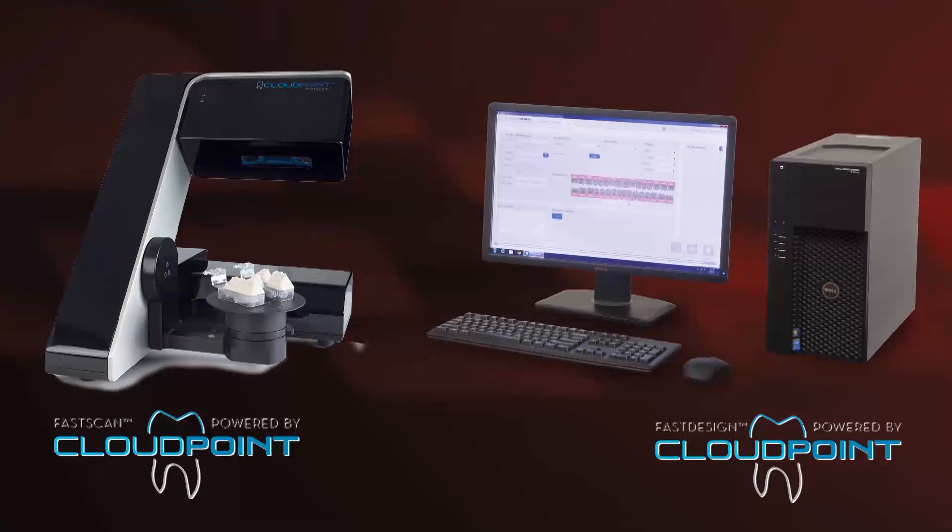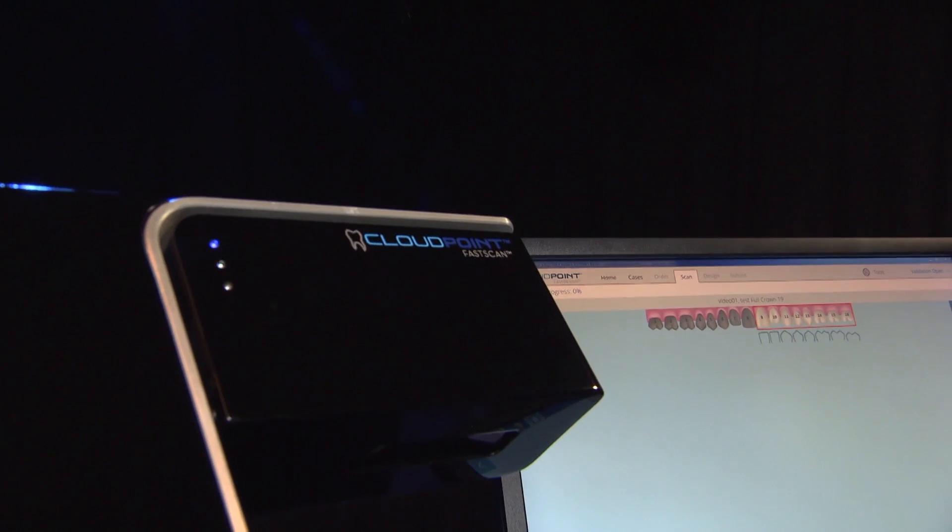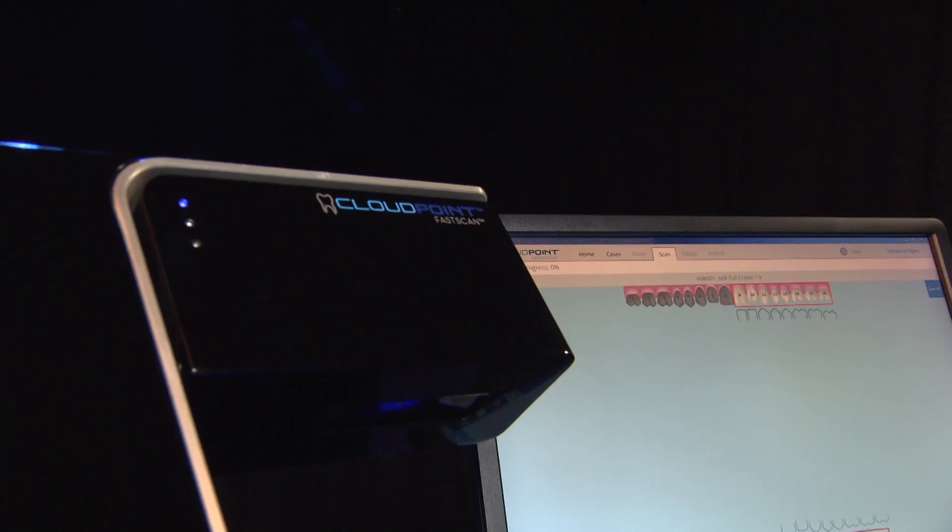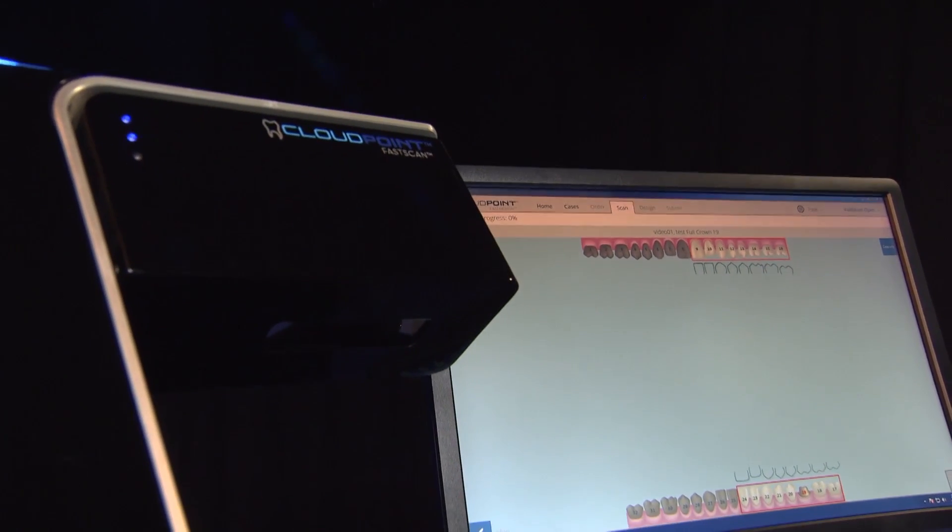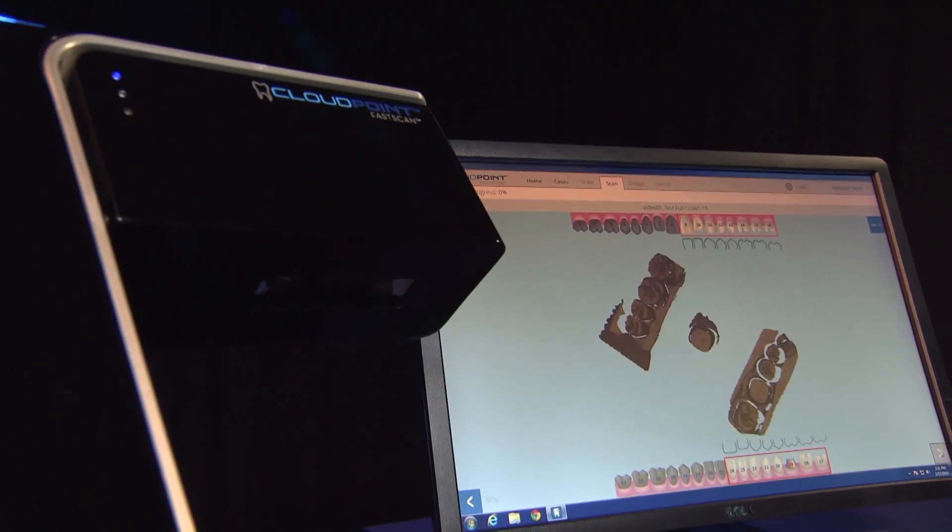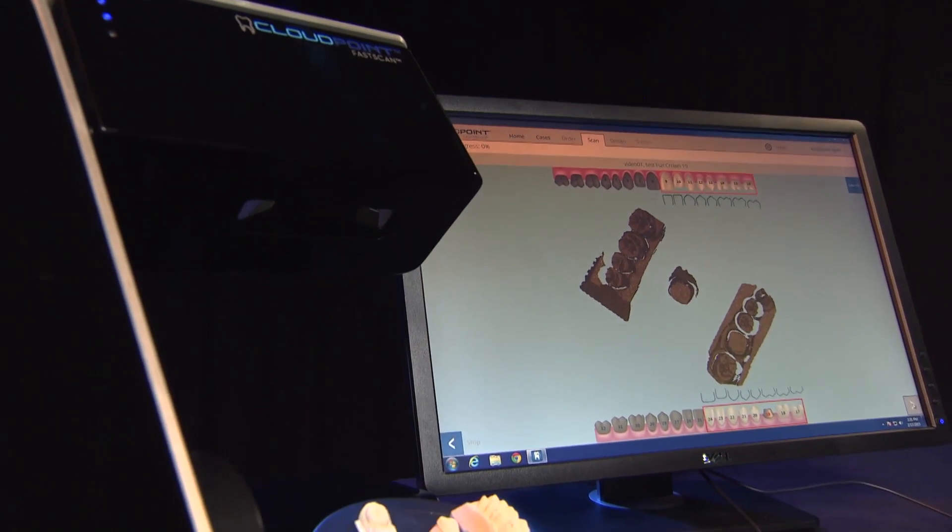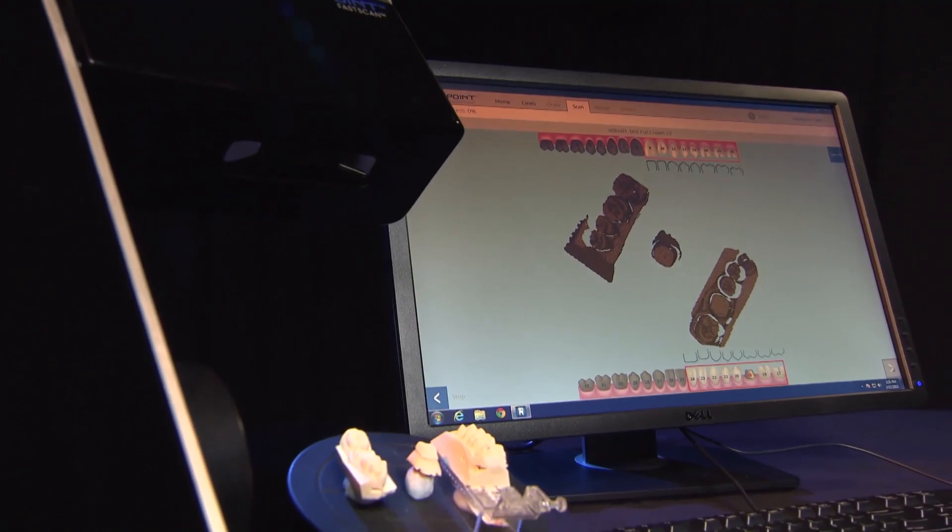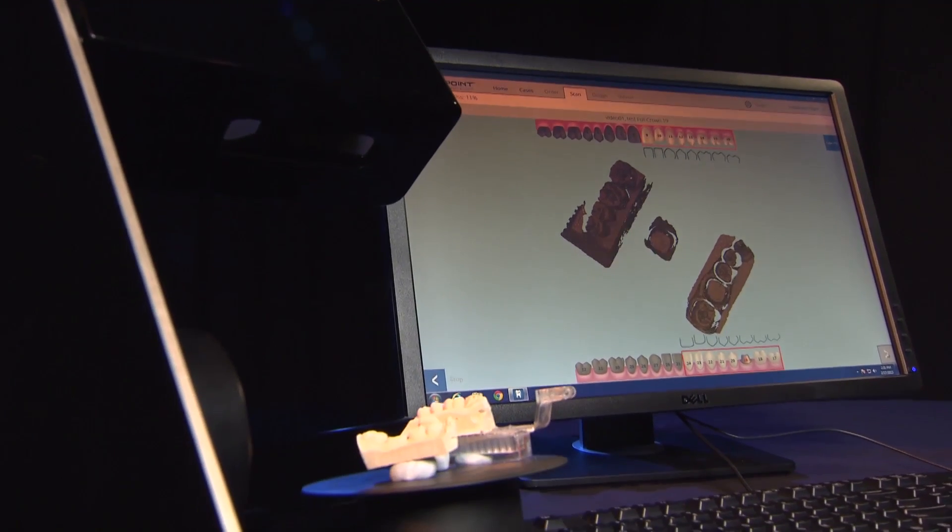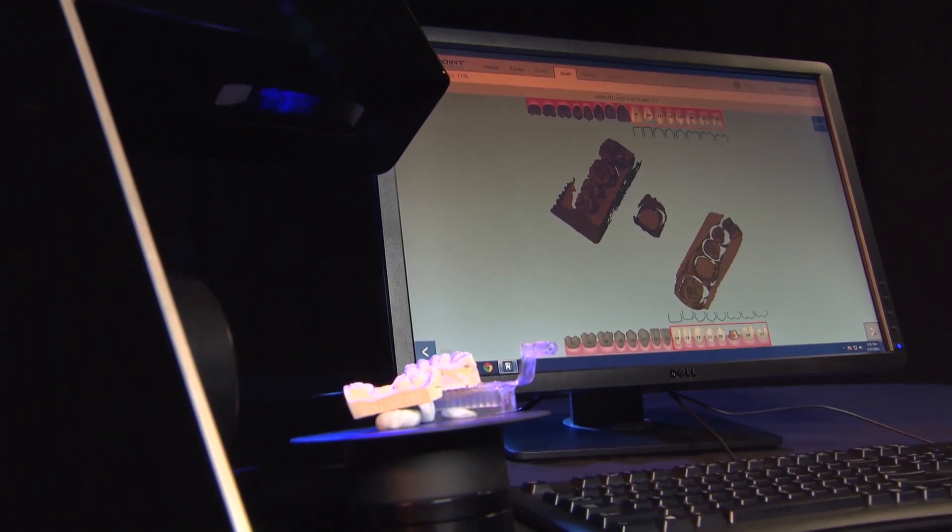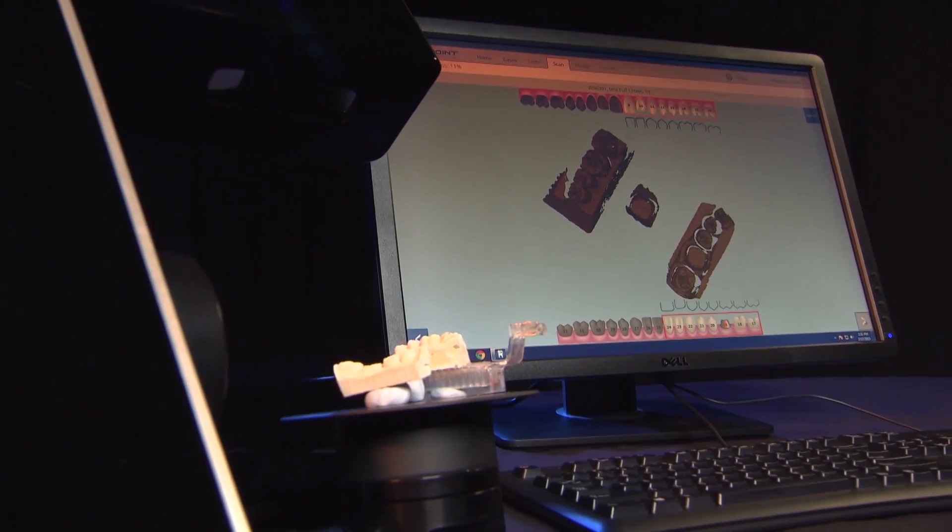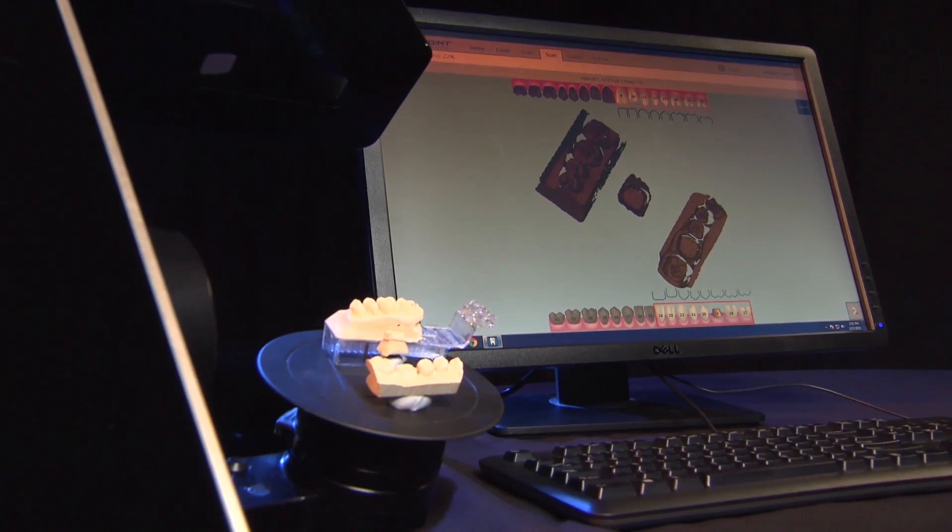What I wanted to show you this week for the case of the week is something that we're launching at Chicago Midwinter this week. It's actually called Cloud Point. It's really designed for laboratories, but you can see a dentist using this as well. It's a model scanner, and it's something we use here in the laboratory. It's our way of getting a case into the digital environment without having an intraoral scan.